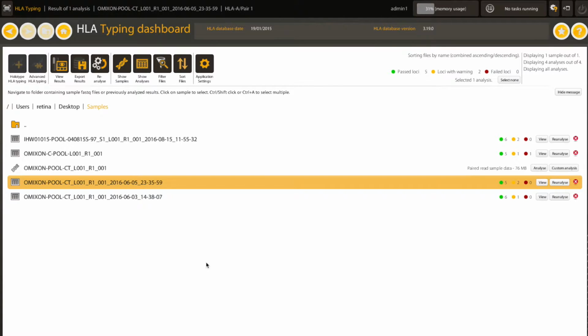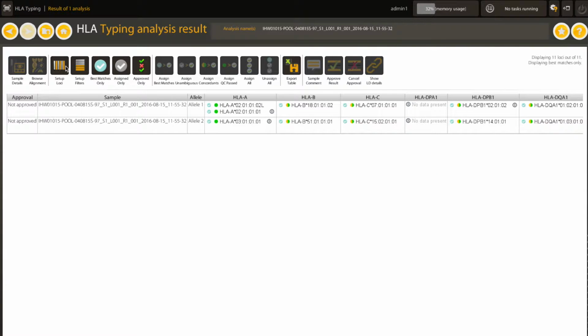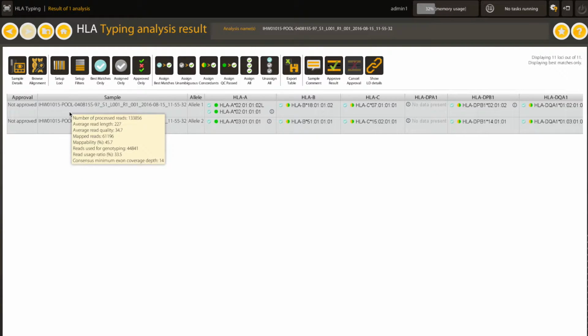On occasion, there might not be sufficient information to phase all of the variants, usually due to long stretches of homozygosity between the two alleles. This is called cis-trans ambiguity or phasing ambiguity, and we will go through the specific cases and consequences of this phenomenon. In certain cases, phasing ambiguity does not cause an allele level ambiguity. We'll look at an example of this first.